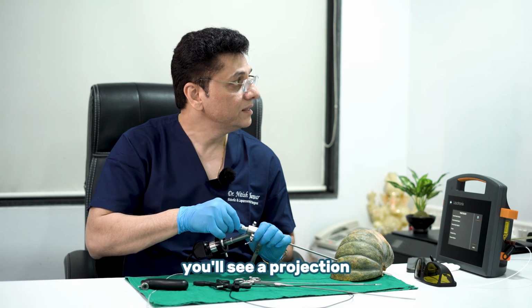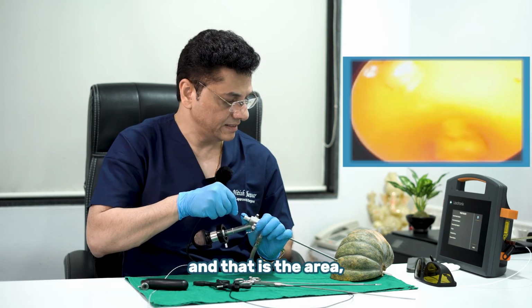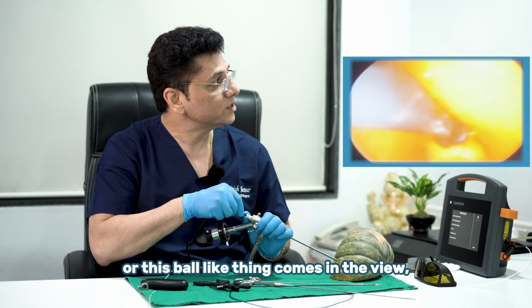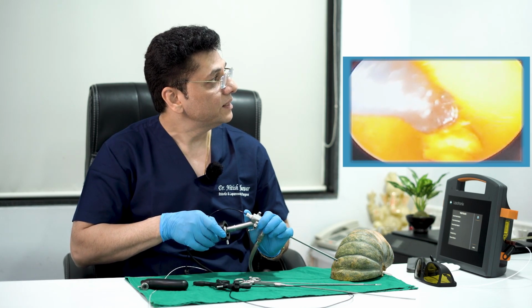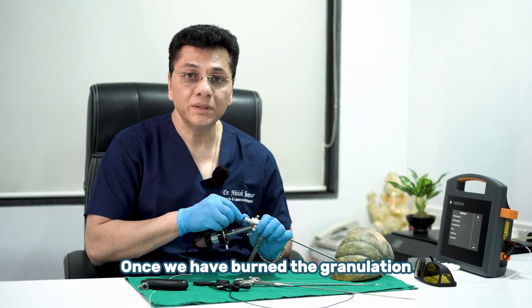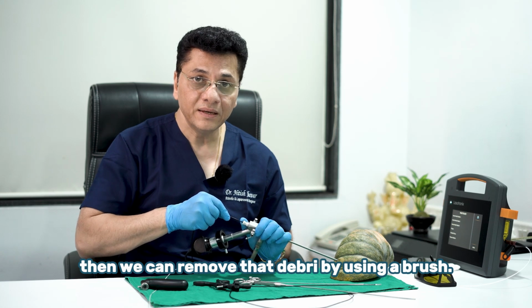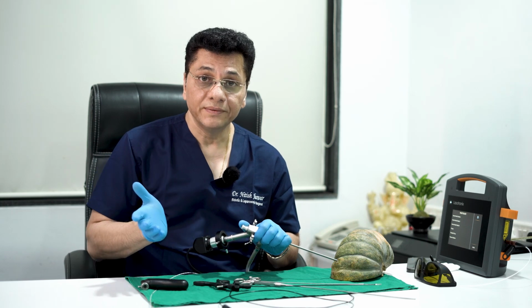In some time, you'll see a projection which is jutting out of the scope, and that is the area wherein we need to start burning the tissue. Can you see this thing which is coming out? So now once this probe or this ball-like thing comes into view, we can start firing the energy, and that can burn the granulation from inside. Once we have burned the granulation from the external opening to the internal opening, then we can remove that debris using a brush.